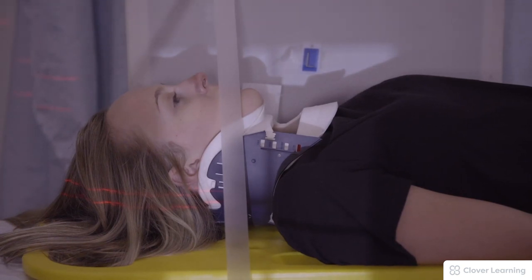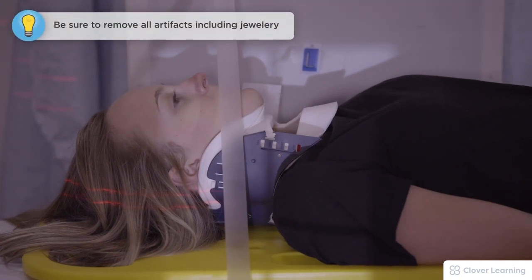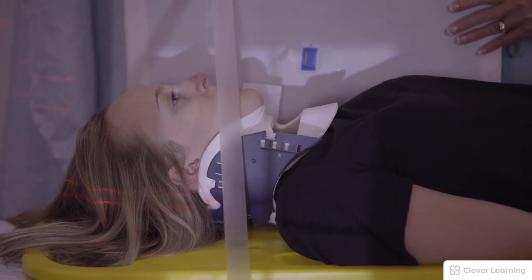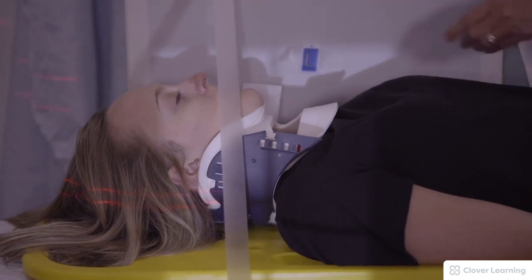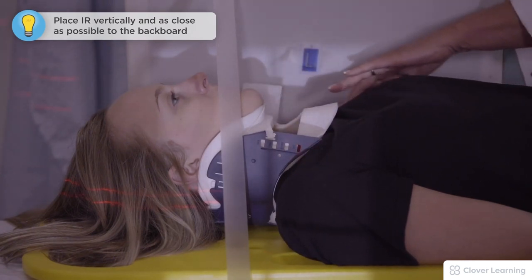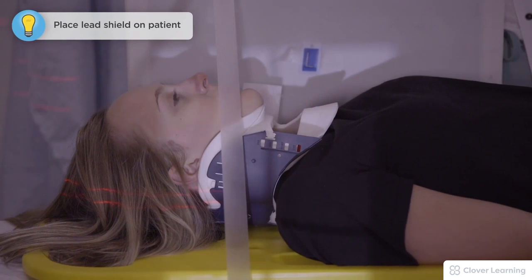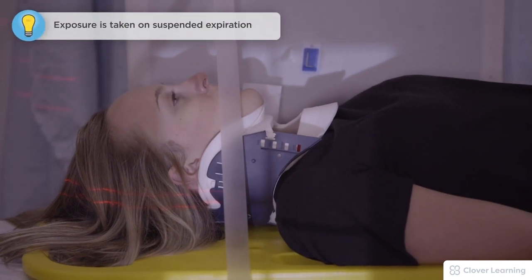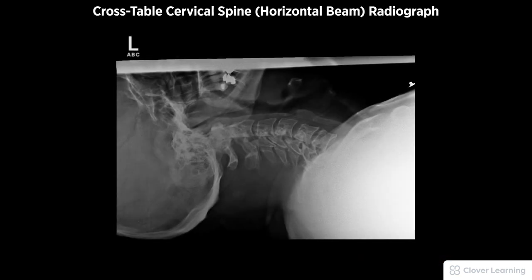With a cervical collar, you want to ensure that there are no artifacts — make sure there are no earrings or necklaces. The IR is a grid-covered IR; we have it taped as close to the backboard as possible. We have relaxed her shoulders, indicated the left side of the body with a left marker, she is shielded, she's going to remain very still, and the exposure is taken.